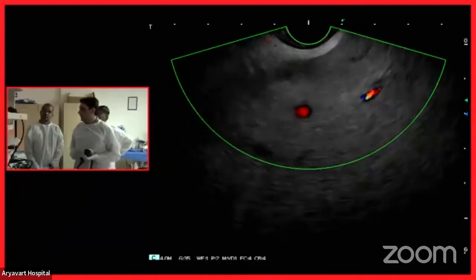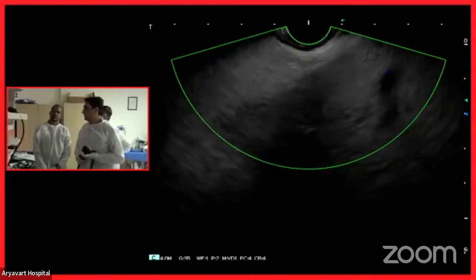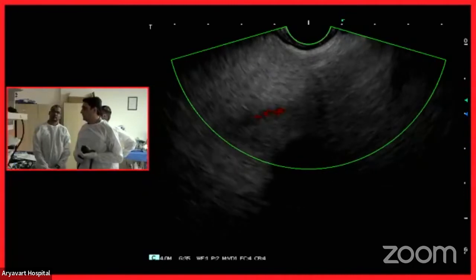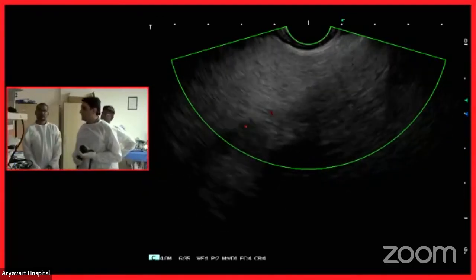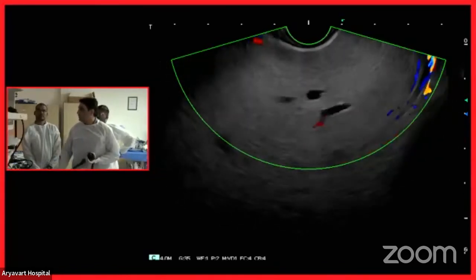With the advent of the portal pressure gradient monitor, a catheter is now available outside India. So I think in the same setting we can also assess the portal vein pressure. So that will help in guiding the treatment. Also, we'll take a biopsy along with it. So any comments from you, Itish?